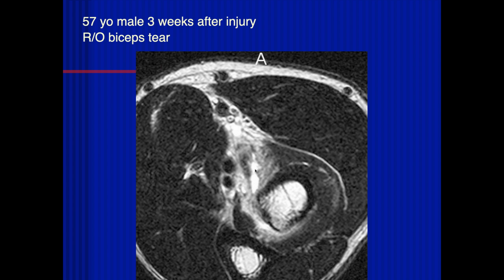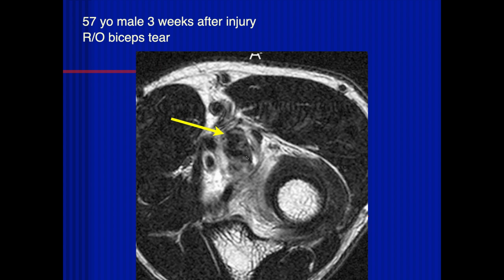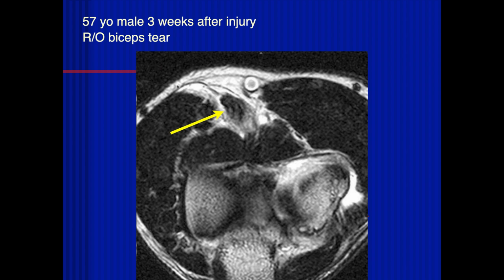Okay. And he was a 57-year-old male, 3 weeks after an injury, ruled out biceps tear, and what we just see is fluid where there should be a biceps tendon here. The biceps is proximally retracted in this particular case. There's the tuberosity. Oh, I'm sorry, there's the biceps, which is torn, and fluid in between the distal biceps, severely tendinotic in this location. Since it's not retracted more than this, if we go forward, markedly thickened, this is going more proximal. Here we can see the retinaculum or the aponeurosis is still intact, and that's why it hasn't retracted more superiorly.